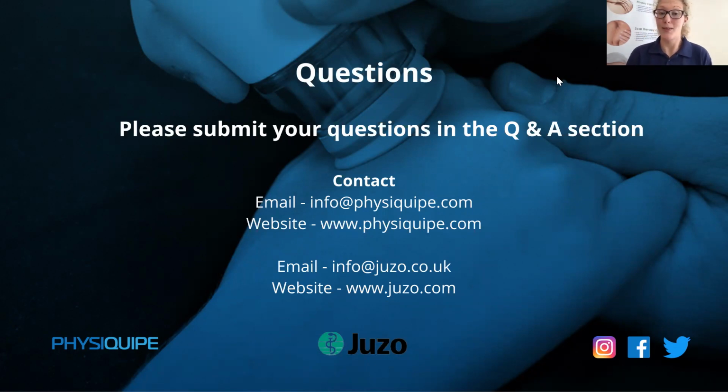And the same especially with the lady with the DIEP flap scar. What was the first thing I wanted to do? We need to desensitize this. So first of all, I used my hands-on. I used the emotional response, getting the client to talk about it, hydrate the tissues, hydrate the area. Let's get that more flexible, more movable, before we get the PowerPro laser in. Also emotionally, it wouldn't have been right to come straight in and get the laser on you. Let's work together, and then let's start to use that.